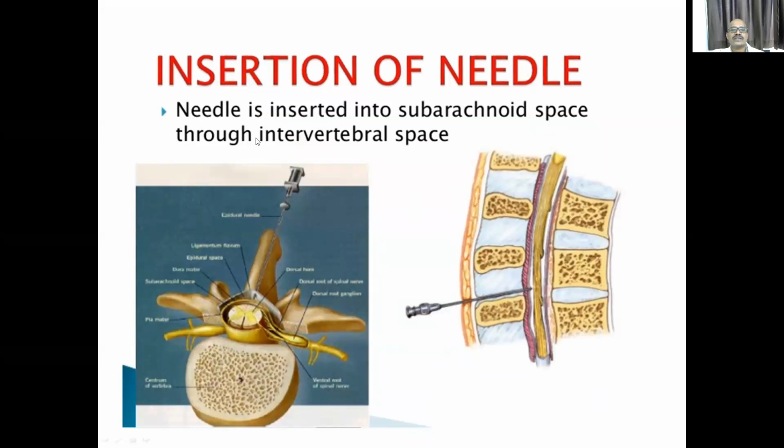So this is a needle, and this is the site where the needle is inserted, L3 and L4. The needle is introduced into the subarachnoid space through the intervertebral space.